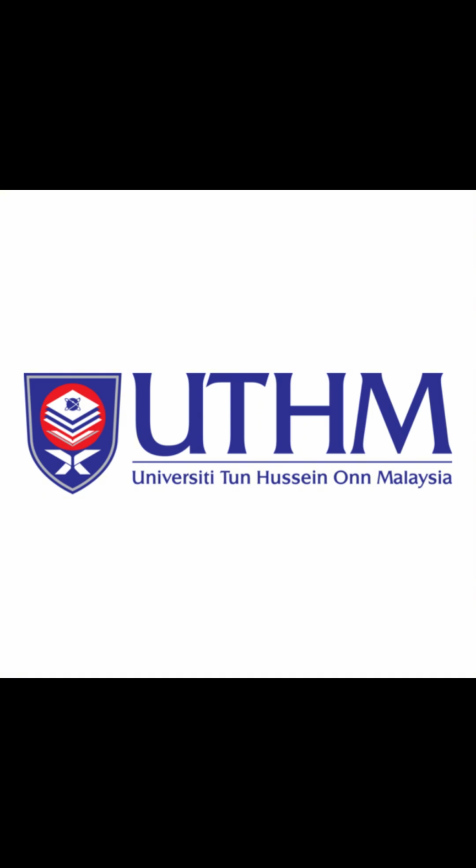Regarding the theme given, which is smart health. This is supervised by our Dr. Hisham. Basically, the system we created is like a video game which can test your balance by using the balance board, related to rehabilitation. So without further ado, let's get into the video and hear the explanation and method.